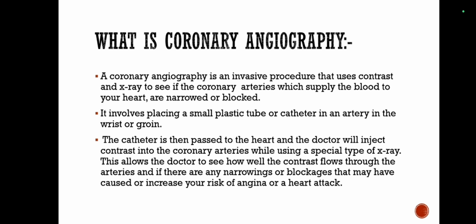A coronary angiography is an invasive procedure that uses contrast and X-ray to see if the coronary arteries which supply blood to your heart is narrowed or blocked. So angiography is a procedure that is minimally invasive, and they use contrast and X-rays to see whether the coronary arteries that are supplying blood to our heart muscles are blocked with any kind of plaque or fatty deposits. So this coronary angiography is a procedure that is helping us to find if there is any block in the blood vessels of the heart.